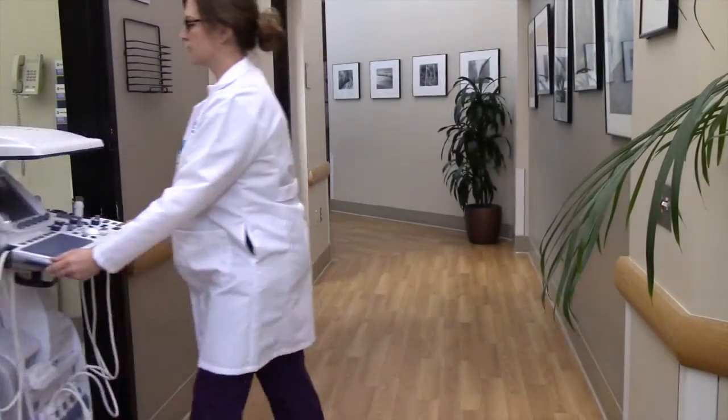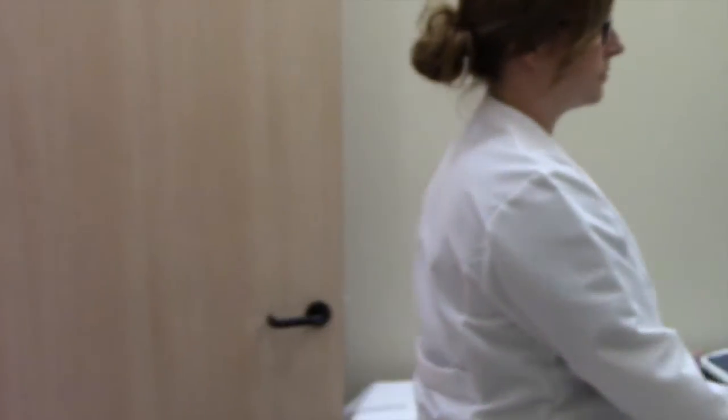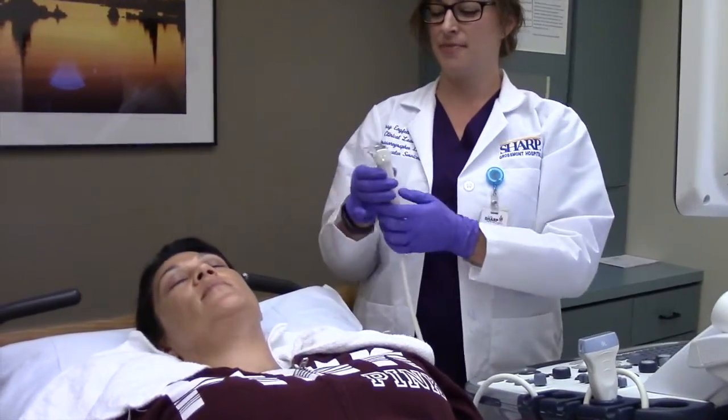With our exam, we bring the machine to the room and take some pictures. There's no IV, there's no venipuncture — they get to stay with their family. It's no different than having any other ultrasound at your bedside. Family members find it more peaceful; they get to see what we're doing and it helps them understand what we're looking for and the testing tools that we're using.